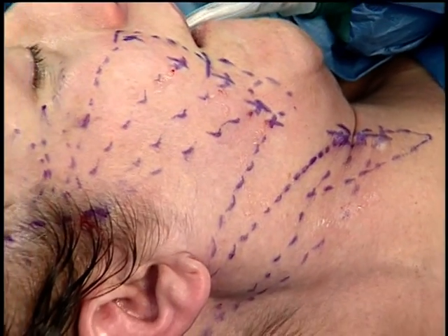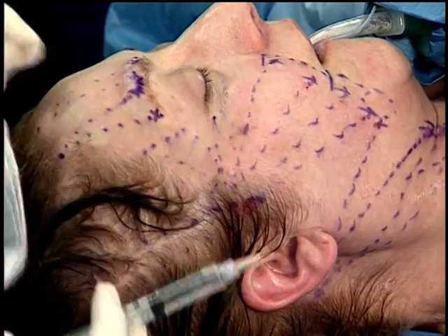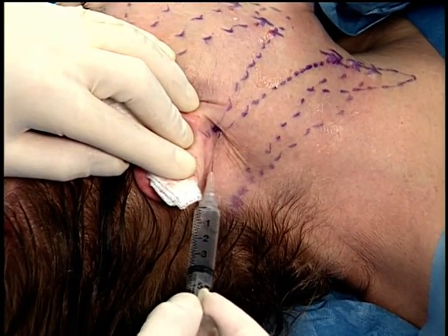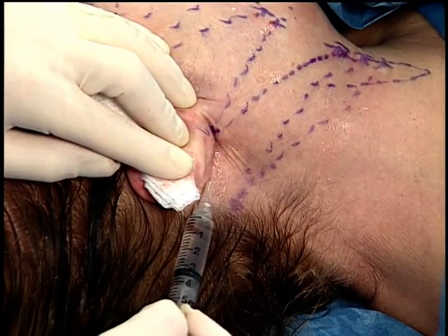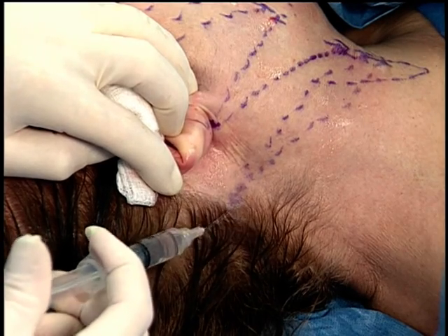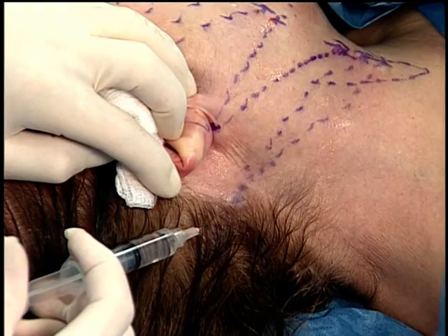We'll do our deployment and our anchor points in the temporal tuft. We'll lift the lobule up and out of the way and do our deployment and anchor point in the retrolobular area, and along the pre-cervical border, the pretracheal border of the cervical neck, our deployment and anchor point.